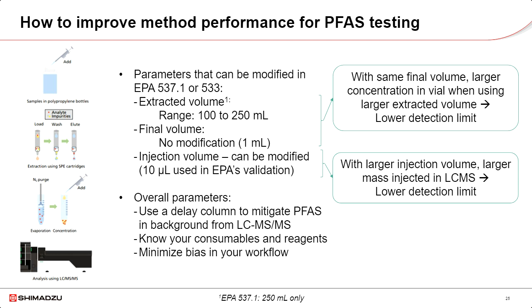Why did I go through all those calculations? Because I wanted to remind everyone of some of the basics that we learned in the analytical chemistry classes. And especially because if we want to improve the sensitivity of our method, what we are truly doing is increasing the mass of the compounds of interest that makes it into the detector.